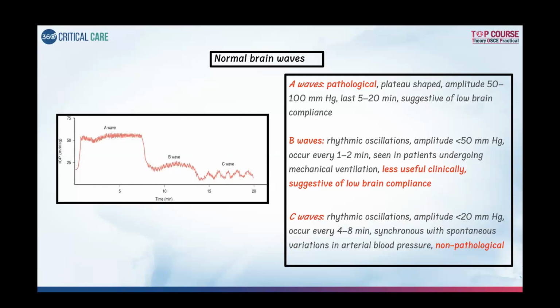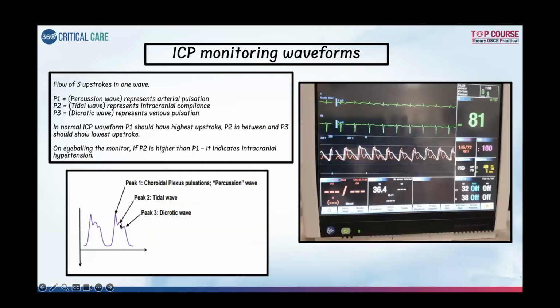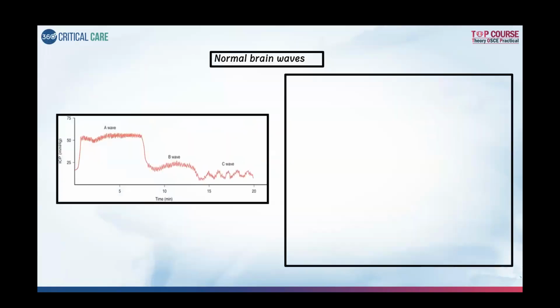But usually in our clinical monitoring, we don't monitor waveforms with this. This is all theoretical that has been seen in different experiments. In clinical sense, we see a single waveform like this or this one. If you squeeze it, like if you decrease the frame rate, getting hundreds of waveforms in one screen, then you can get this pattern like this, the way it is, right?